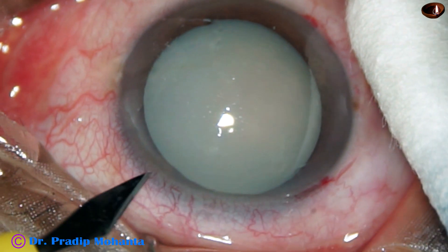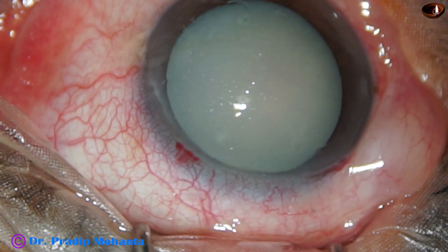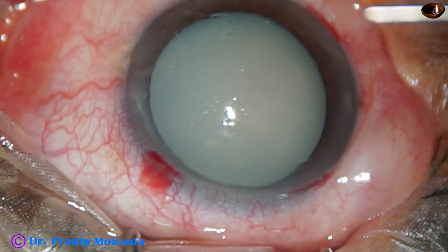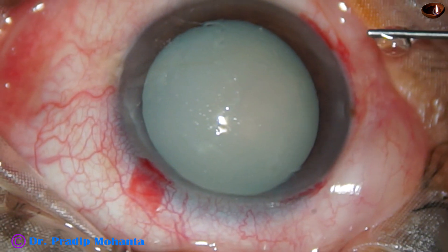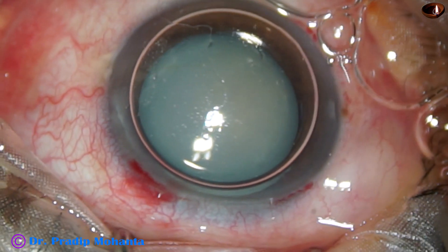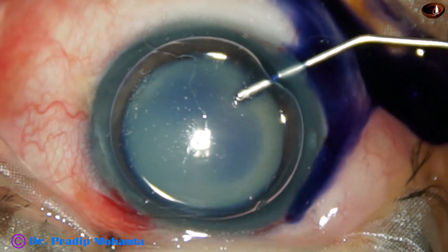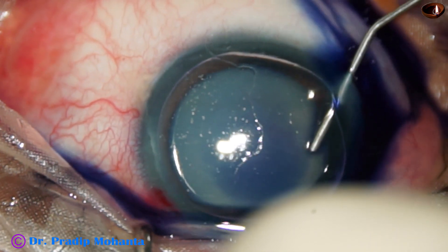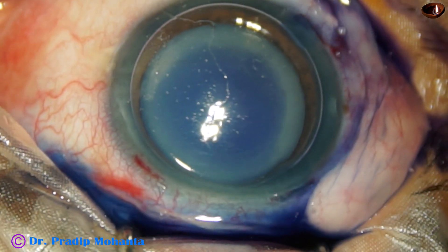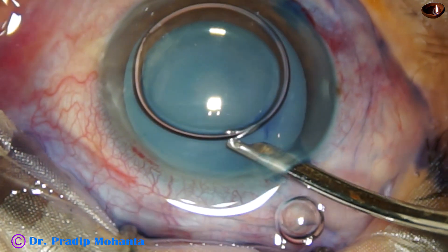By this time the main incision and two side ports have been made. And now an air bubble is injected into the anterior chamber. Remember, I always use an air bubble to stain the anterior capsule of these white cataracts. Because when we stain the capsule underneath an air bubble, the dye required is less.